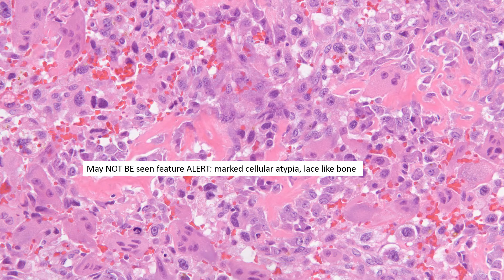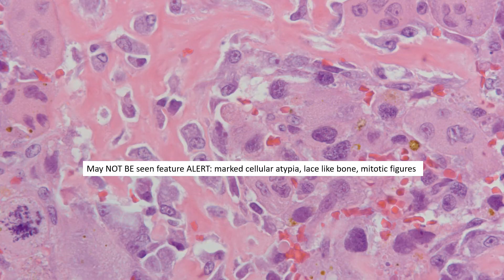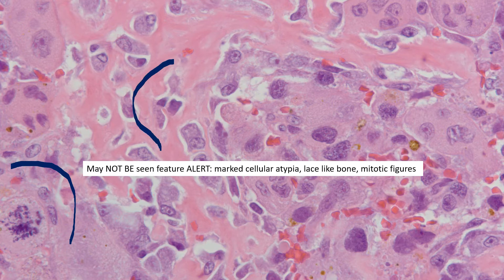Now, switching gears: features you will NOT see in osteoblastoma. You will not see a lace-like network of osteoid — this, to me, is lace-like. You will not see significant atypia: these nuclei are much more pleomorphic, the chromatin far more granular and hyperchromatic. And you will not see atypical mitotic figures, as seen here. That lace-like osteoid is an osteosarcoma masquerading as an osteoblastoma. So the three key features you will not see are: marked cellular atypia, lace-like osteoid, and atypical mitotic figures.